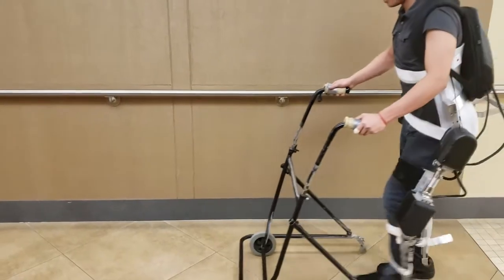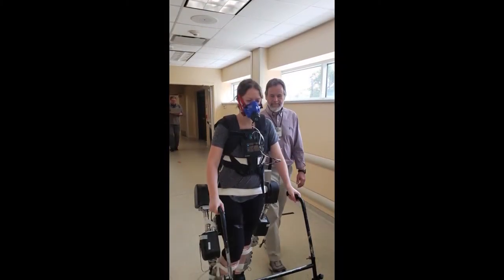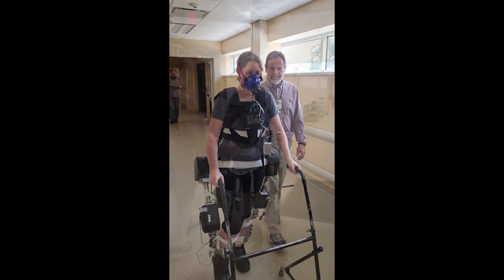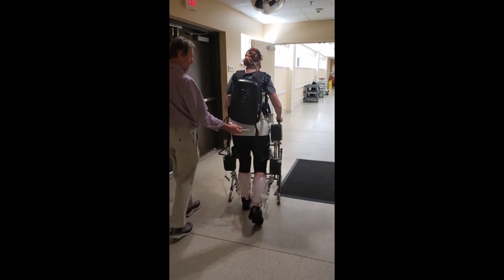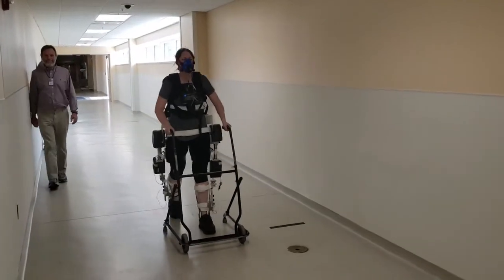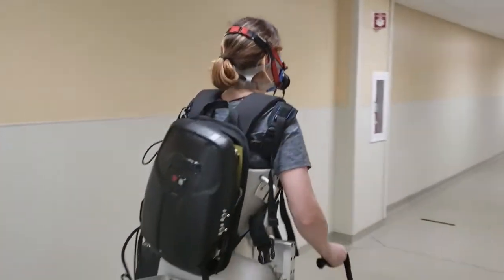Part of the assessment of the CPWS is to determine the rate of metabolic consumption during usage of the device. Due to its unique back-drivable design, the SCI exoskeleton pilot can move the system using neural stimulation of the lower limb muscles. To assess metabolic consumption, able-bodied pilots were instructed to move the system under their own power while wearing the K5 metabolic system. Ideally, the CPWS should be invisible to the user, so any increases in the metabolic consumption indicate that aspects of the system impede the user's generated motion. We've found that the amount of viscous damping at the joints has a significant effect on metabolic consumption.